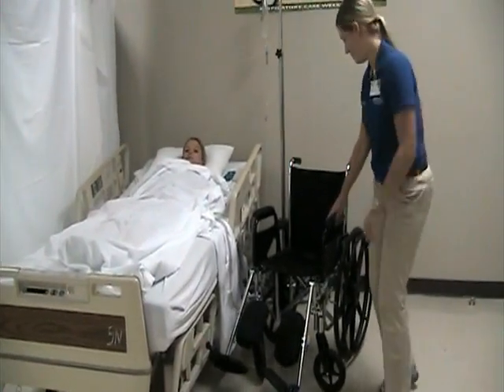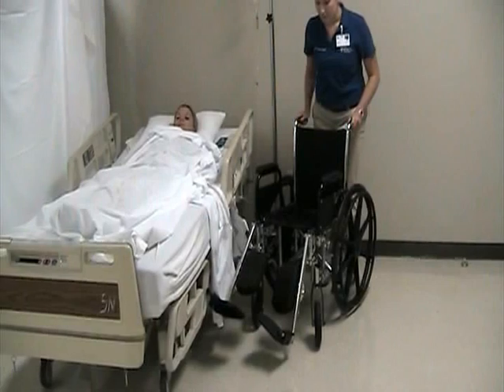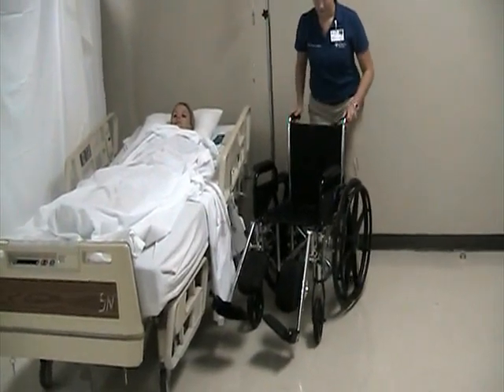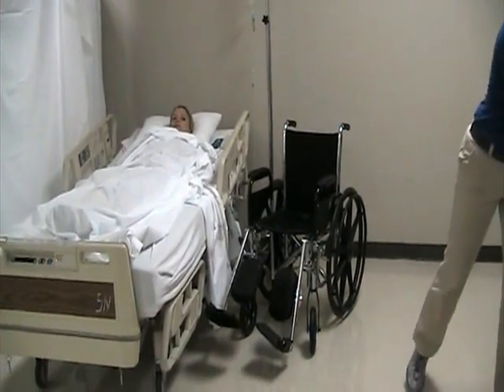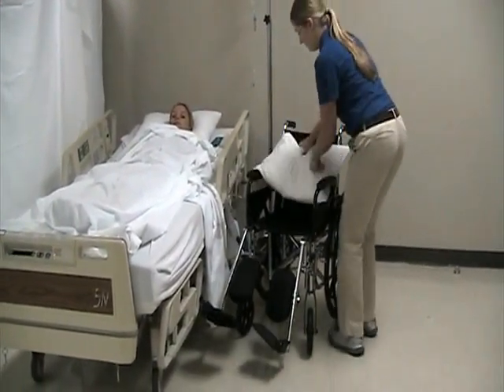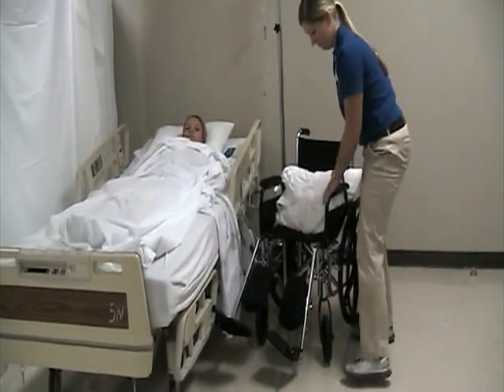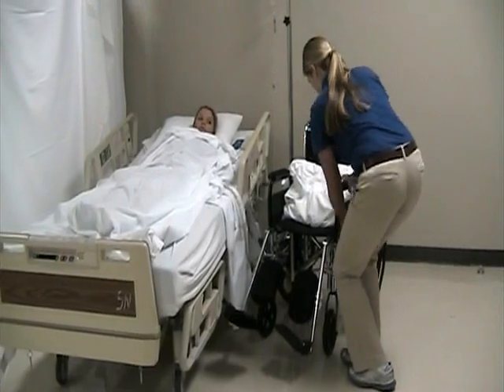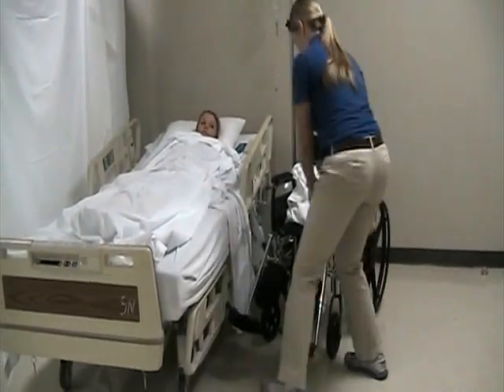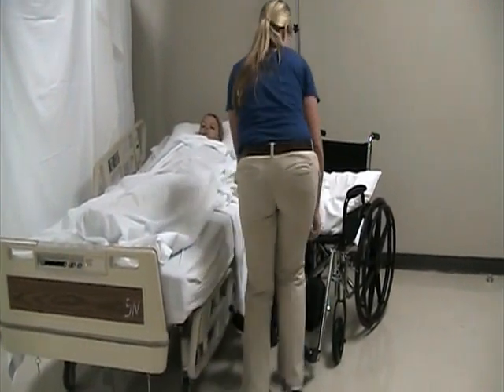Okay. All right, first the PTA will set the wheelchair next to the bed. She'll place a pillow on the seat of the wheelchair in order to help the patient with comfort and leaning back for hip precautions. She'll set the caster wheels forward, lock the wheels, and remove the legs.